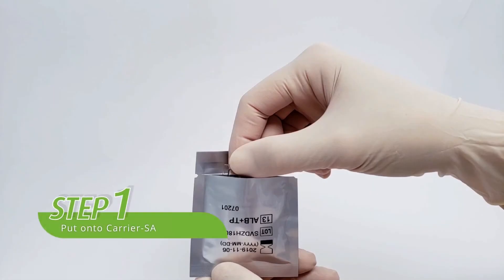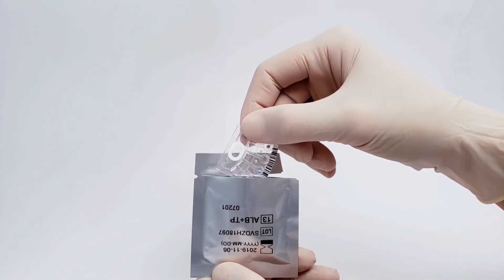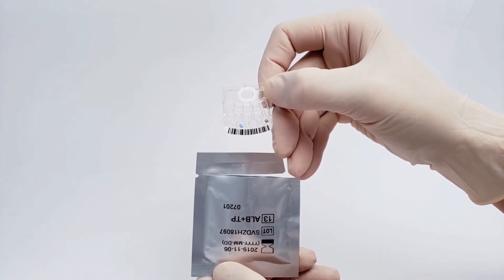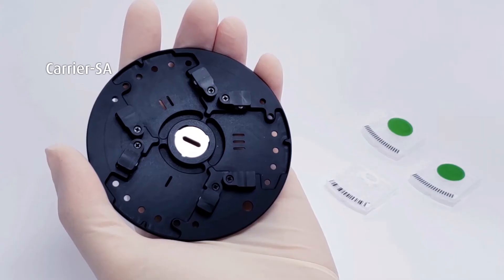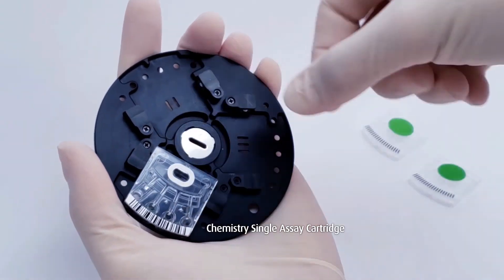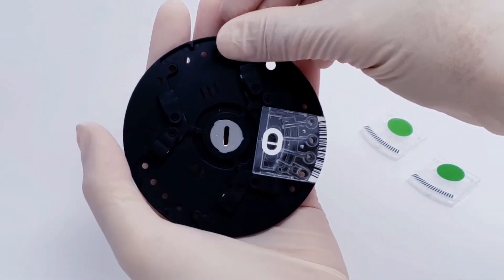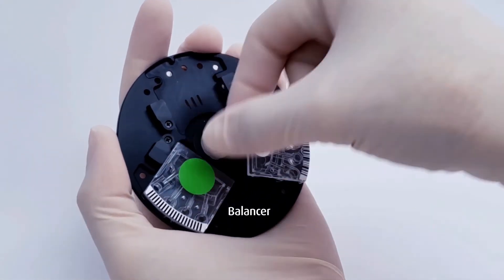Let's get started with the first step. Open the foil pouch and take out the chemistry single assay cartridge. Hold the edge of the single assay cartridge to avoid contaminating the optical detecting areas. Then put the cartridge and balancer onto the Carrier-SA. Three cartridges are required to be loaded on one Carrier-SA; place balancers onto other unused slots.